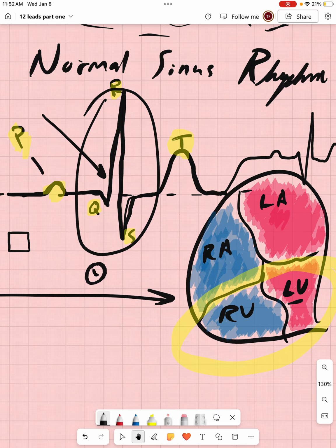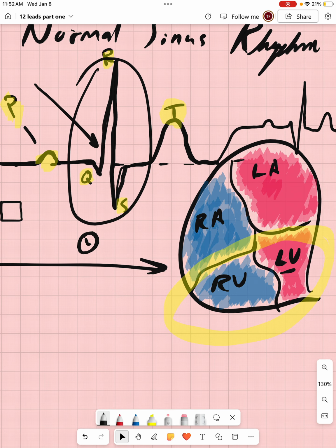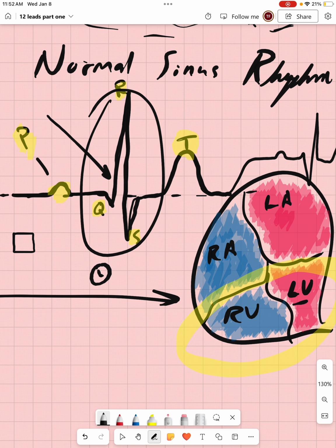And when you have these things, you have a sinus rhythm. Sinus referring to the sinoatrial node. So many terms and phrases, your mouth and brain kind of turn into marshmallows after a while. But hang in there. We're doing great, and we shouldn't have too much further to go here.